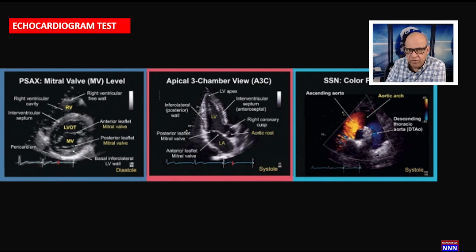I was certified to do echocardiography in my practice. I did echocardiography for more than 35 years in my office because I had a beautiful HP Dimension 8 echo machine, and I loved doing echocardiography.